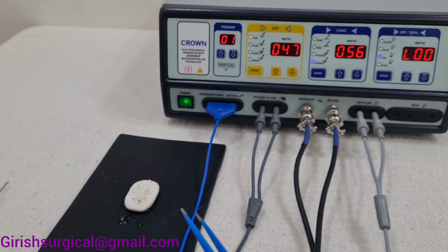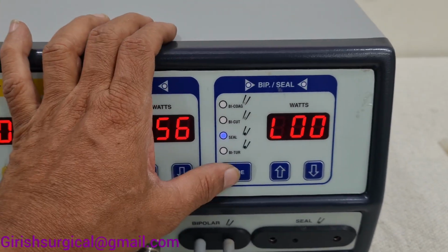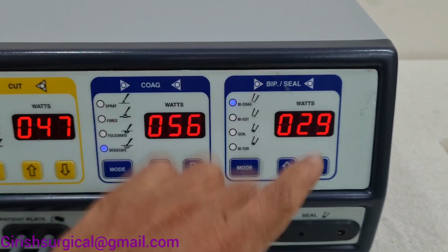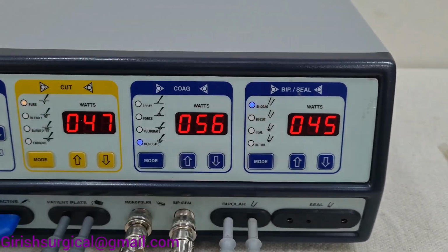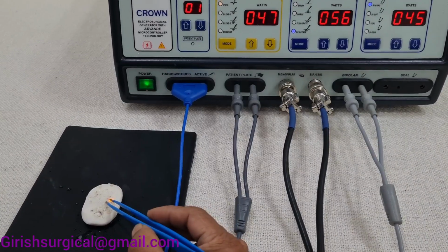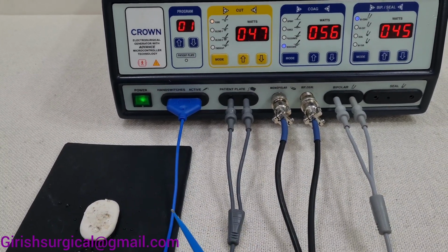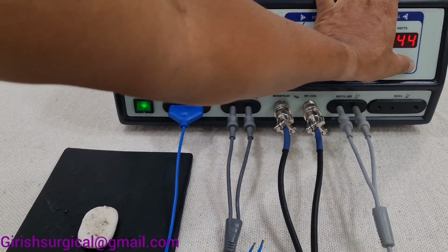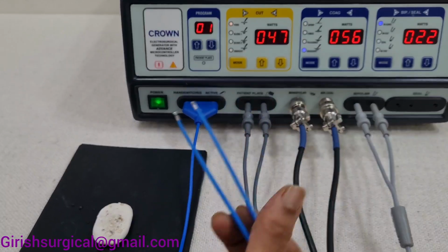Bipolar will be operated with. Now we'll be operating the bipolar. In the bipolar, you have to go into the bicog. Now we are into bicog. We'll increase the intensity a little. Now we'll check it. You can increase or decrease the intensity according to your requirement. We had kept it on 45. We'll decrease it a little. This is how bipolar you have to use.